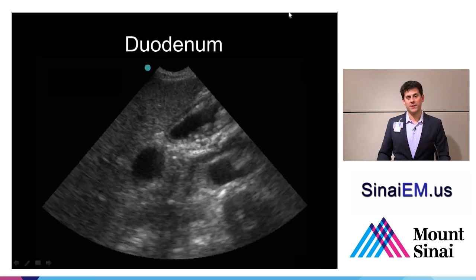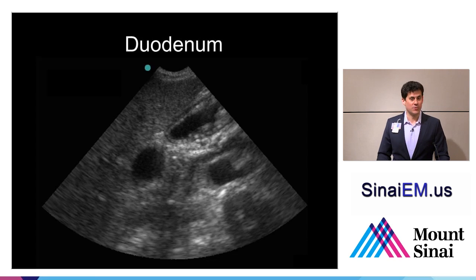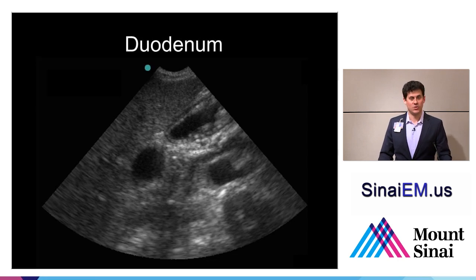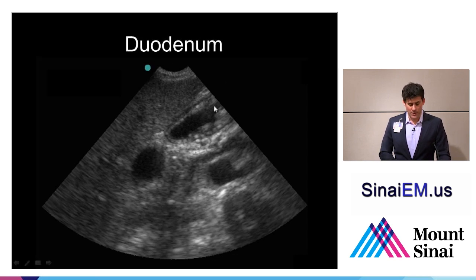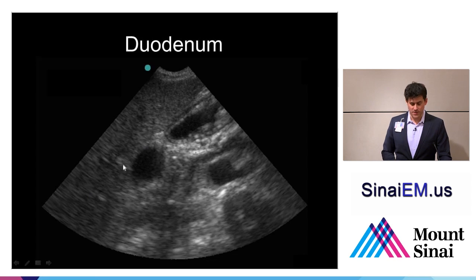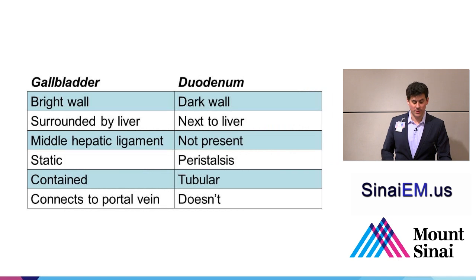Another structure that's really important to keep in mind is the duodenum. The duodenum is a fluid-filled structure that exists in the right upper quadrant, right near the liver and the gallbladder. The duodenum can look like a terrible-looking gallbladder — it can look like a gallbladder with an inflamed wall, stones, sludge — and can fool you when you're first starting out into thinking it looks like a pathologic structure. Here we can see the duodenum, the gallbladder, and liver taking up the left side of the screen.